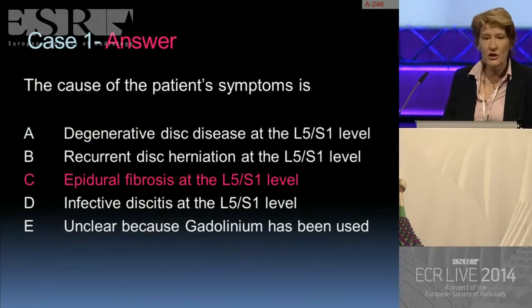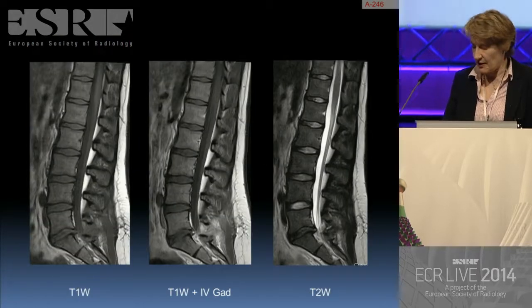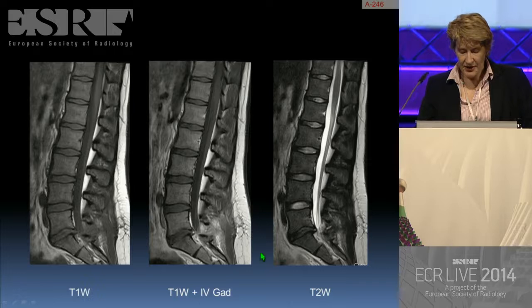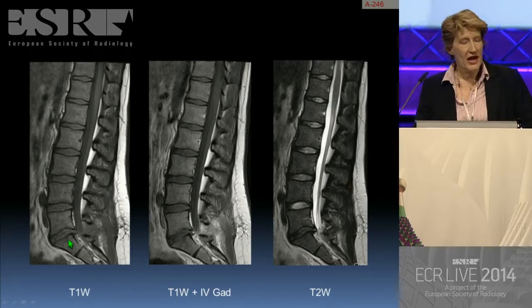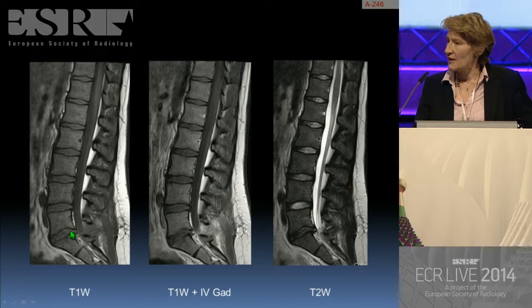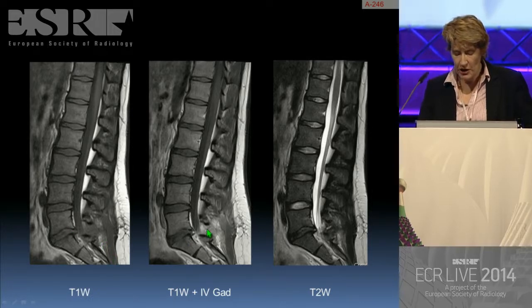We'll just go through those images again. Here one can identify that certainly surgery has been performed at the correct level, which is always an important point to note.